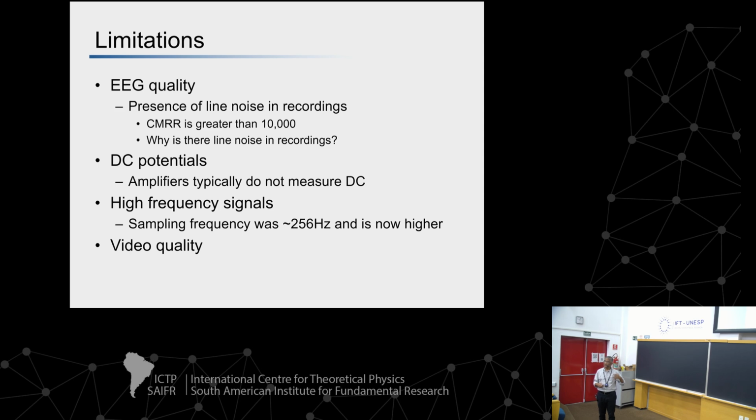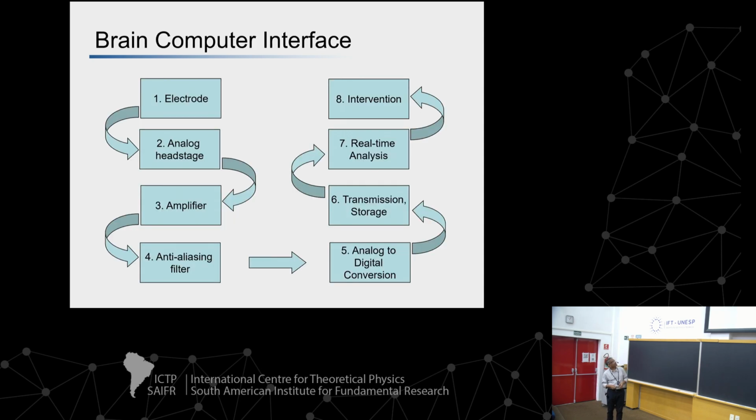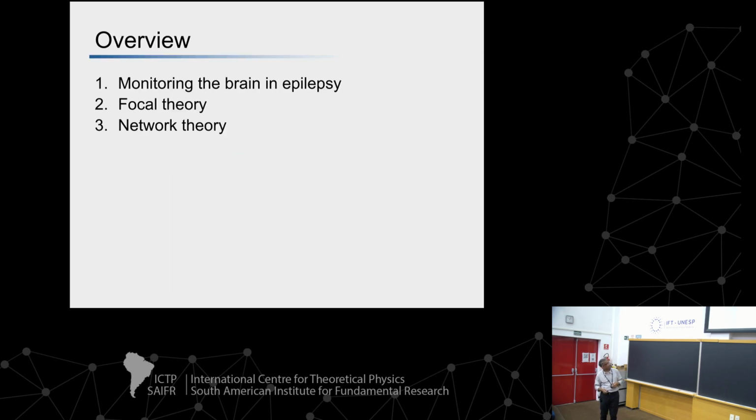The video quality over the years has improved. We use the video a lot for decision making, and these compression standards were meant more for VHS tapes or putting information on DVDs, as opposed to clinical decision making. Say you want to know if someone's blinking or not, or having facial muscle twitches, it would be difficult to capture that, but over time this has improved tremendously. So I'm going to skip over these few slides. I might touch on them tomorrow.